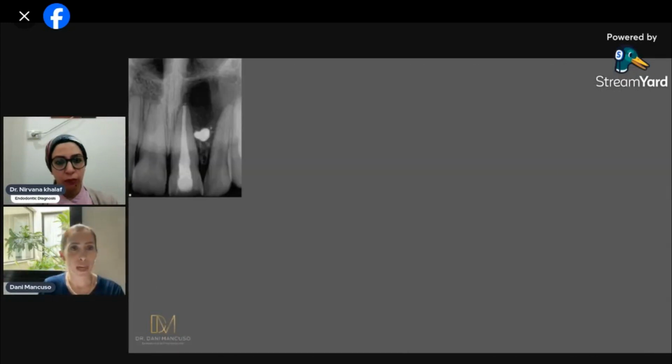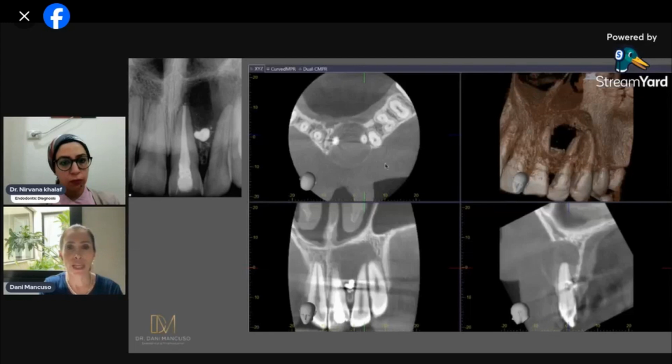What about this one? Well, it was a trauma case. The root canal treatment was done. There was an extruded material, and I believe that it was apically extruded, and once that area started to grow, it moved that more coronally. The treatment was, this lateral was completely necrotic. We took a scan and we saw the radiolucency quite large. The canine was a bit inconclusive as well.